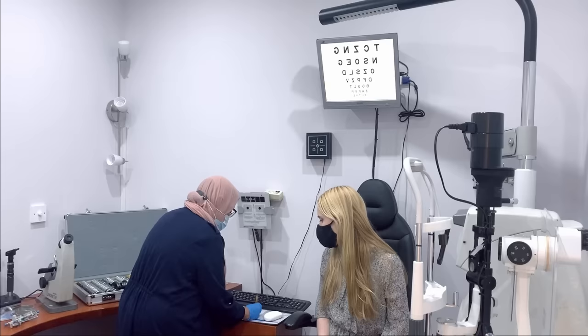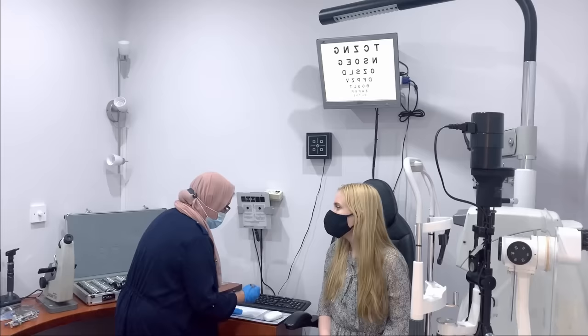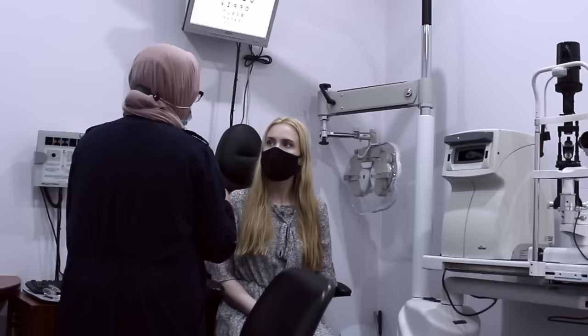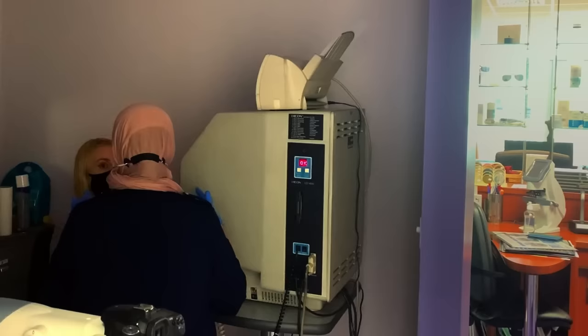All right. And generally, glaucoma runs in families. So if you don't have a family history, it's unlikely you will. However, because you're short-sighted, it's always good to take all these readings so that we know. So the other thing we're now going to do is look at the back of your eye with a digital camera, and we're also going to do your peripheral vision. For us to do that, we're going to go to another room. We're going to do something called your field of vision, yeah? Okay. Come and sit over here for me. Take a seat there. So this is a field of vision in the sense it looks at your peripheral vision, but it also looks at the way the optic nerve travels to the back of the brain, how the information goes across.